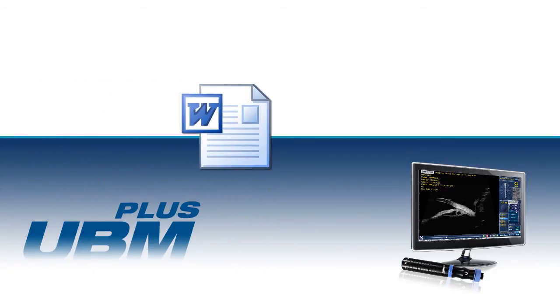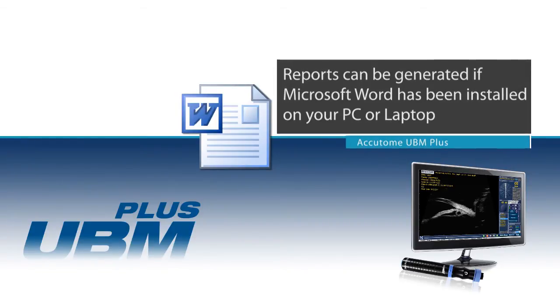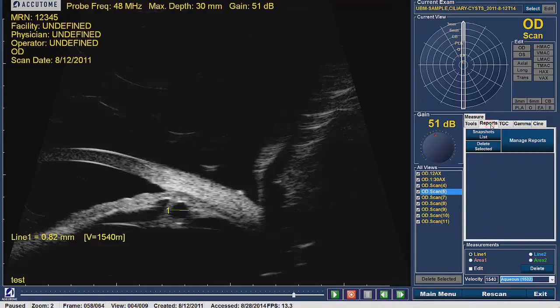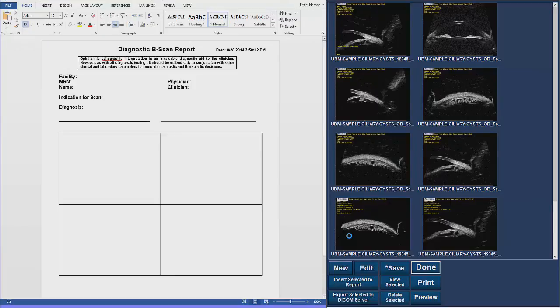Once all recordings have been reviewed and all snapshots have been taken, a report can be generated if Microsoft Word has been installed on your computer. To create a new report, click on the Reports tab located on the right-hand side of the screen and choose Manage Reports. Saved images will be on the right-hand side of the screen. Select New at the bottom of the screen and a new Word document will be created on the left. The document template allows for easy entry of diagnosis, indication for scan, and images.